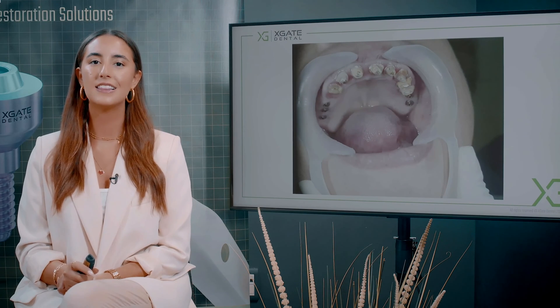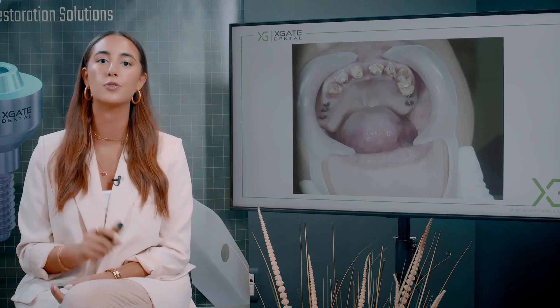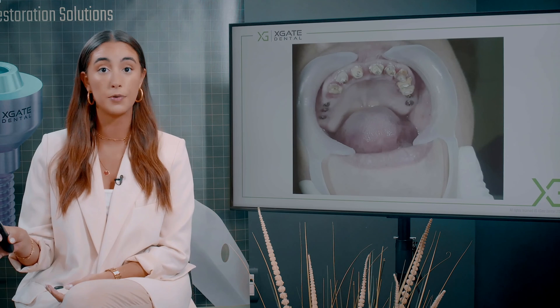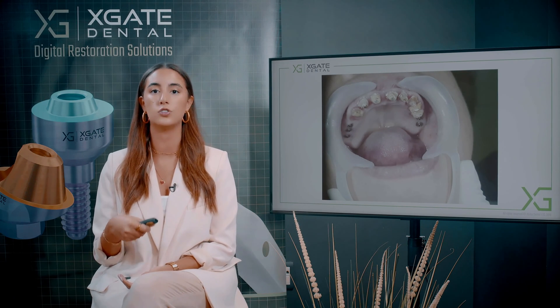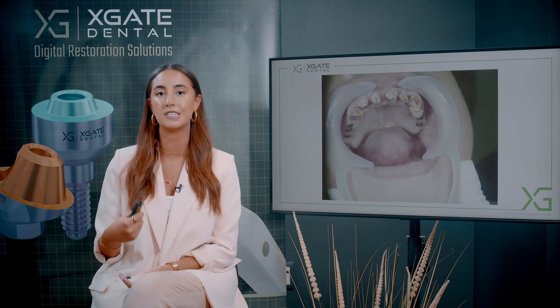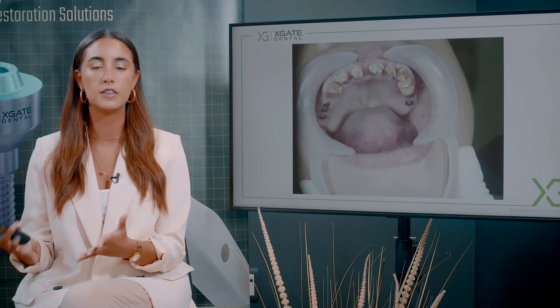You can see the teeth after some preparation and cleaning. The metal parts on the incisors are the teeth that had root canal treatment a long time before the previous bridge was made. They had a post and core installed in the root canal for better fixation of the bridge. So why make a bridge and not just remove all the teeth and make a denture?